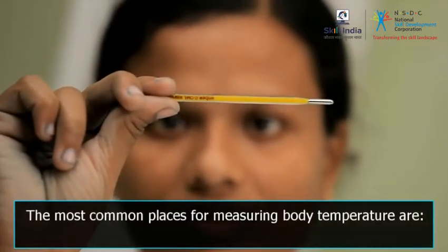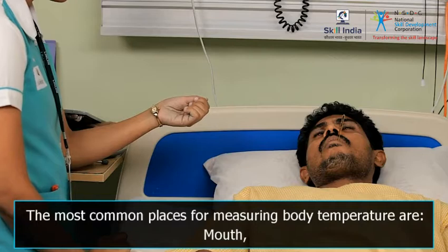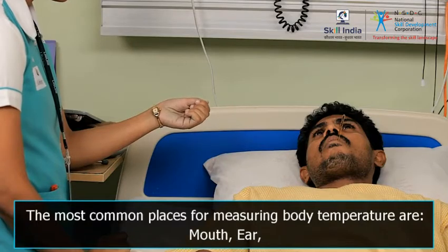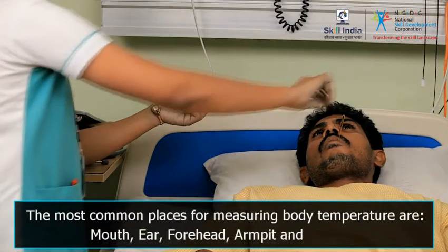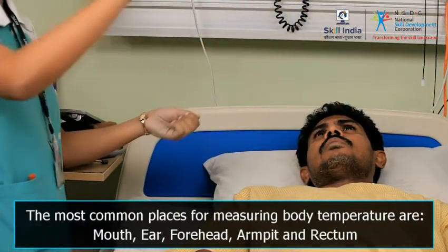The most common places for measuring body temperature are mouth, ear, forehead, armpit — also called the axillary method — and rectum.